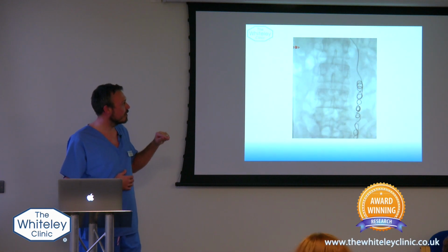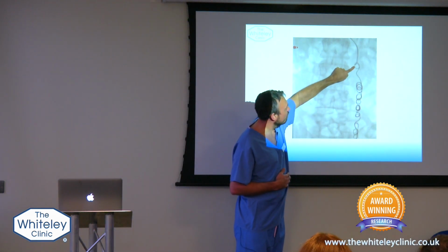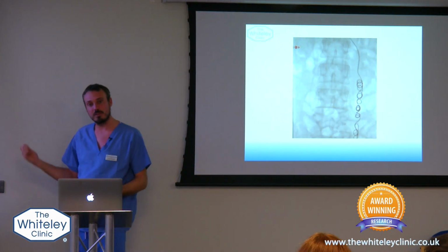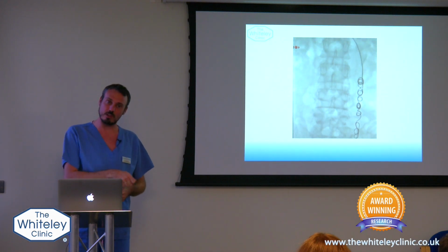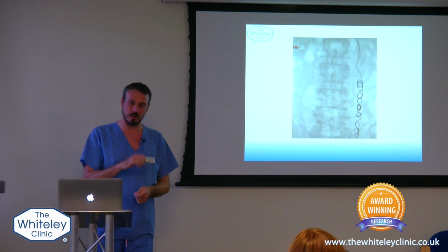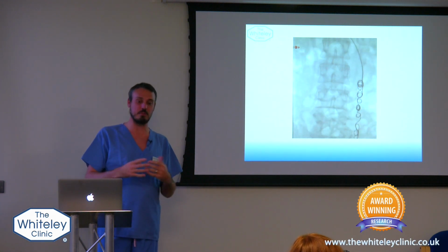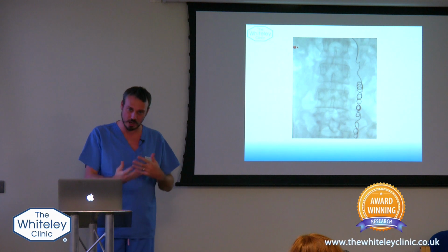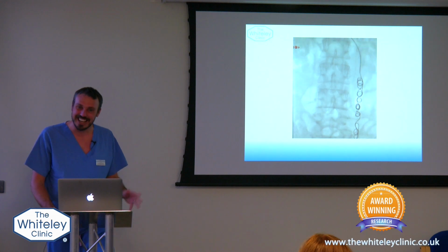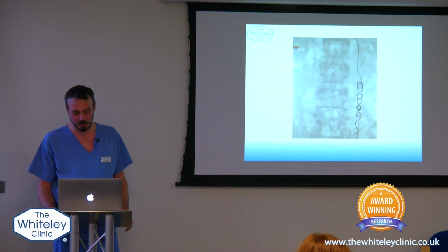And the reason that they're quite special is because, and you can see here what I'm doing, this is the catheter tip, and I'm pushing the coil out, and then I don't like where it is, so I'm pulling the coil back. So the coils are called repositionable coils. If I don't like the position of the coil, I can pull it back into the catheter, say, nah, I don't like that, change the position, and put it into a better position. Rather than you put the coil out and think, oh, I don't like that position, but then it's out, I can actually change the position. Obviously, once you go away from having had the procedure done and the vein clamps down onto the coil, the coil is in there from that point on.